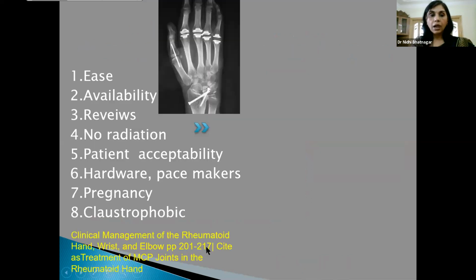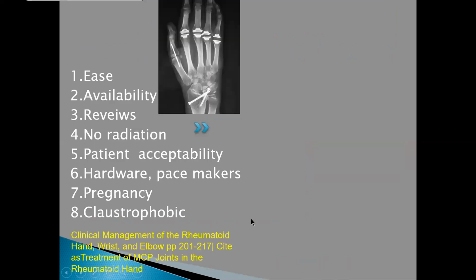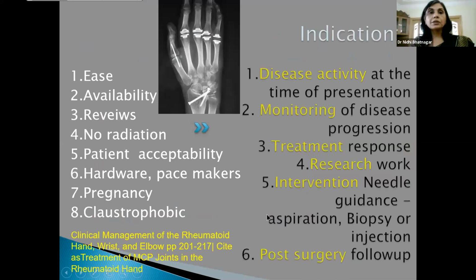All right, yeah. So rheumatoid arthritis, as we all know, is a chronic inflammatory immune-mediated systemic disorder, and it involves joints classically. The past decade has seen several advances in ultrasound imaging and evaluation of joint damage and inflammation in rheumatoid arthritis. How applying this ultrasound in the diagnosis of rheumatoid arthritis has completely transformed the clinical practice will be the key aim of this presentation today.